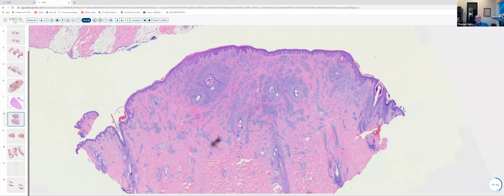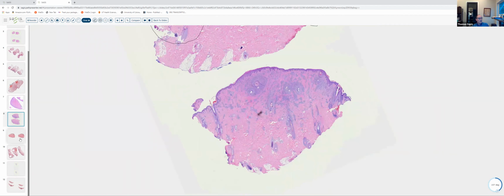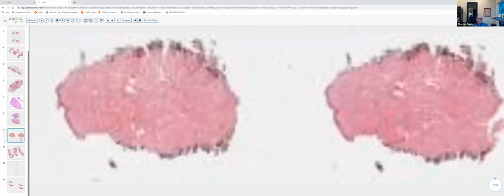So again, if you see on a board exam a hypertrophic scar with naked hair shafts and evidence of a suppurative folliculitis, where they're going with that is usually acne keloidalis. Okay, let's go ahead and move on to our last 4 slides. The first slide was, at first blush, a little underwhelming.